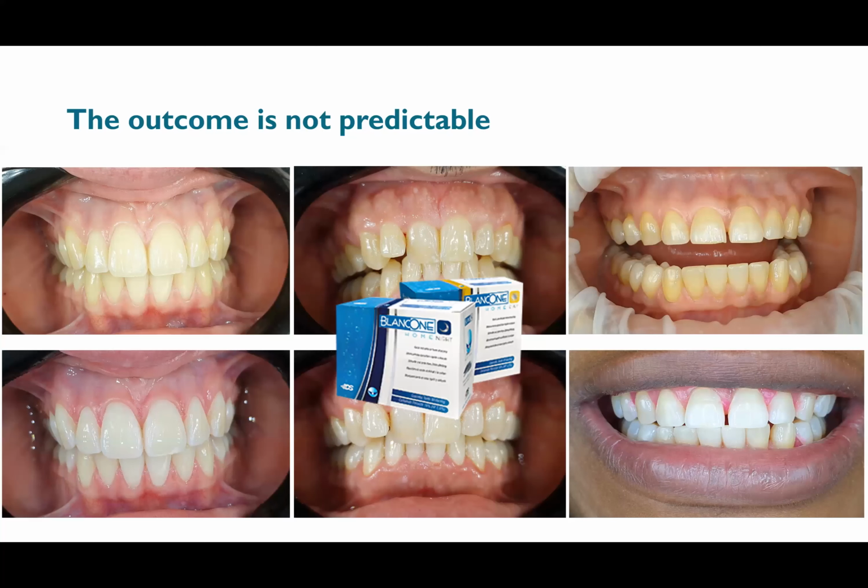On the right corner, yeah, that is an impressive result. I didn't expect to obtain this much of a result, but it was a yellow color, so it was easier to obtain a good result, and the patient was pretty happy. And this patient alone sent me 10 other patients. She sent me all the family because they were having a wedding in 2 months, so she sent me all the family to do prophylaxis with GBT and the click. It was great, and the bride had the touch-up. She wanted a little bit more of a white smile.